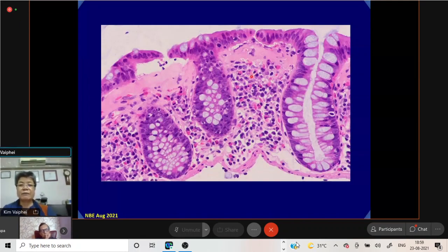Some of the literature says 15 micron. But in a symptomatic individual, even 10 micron will be significant or adequate to make the definitive diagnosis of collagenous colitis in a symptomatic given case. But literature says 15 micron. These will be more than 15 micron, but it's not necessary to wait for the 15 micron to come up. 10 micron with a symptomatic patient is enough for diagnosis. Otherwise, normally it is just 5 to 6 micron thick. So it should be enough to make a definitive diagnosis of collagenous colitis, and the patient should be treated, and he will definitely improve with that diagnosis.